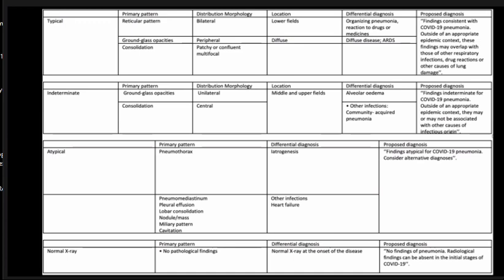Kasi, syempre, always at the back of our minds is pandemic time. Lahat ng opacity na yan. COVID ba yan? COVID ba yan? Ganun naman ang question eh. So, let's help each other, especially our ER consultants. Pagka ganito ang reporting natin, I think mas directed yung action nila.